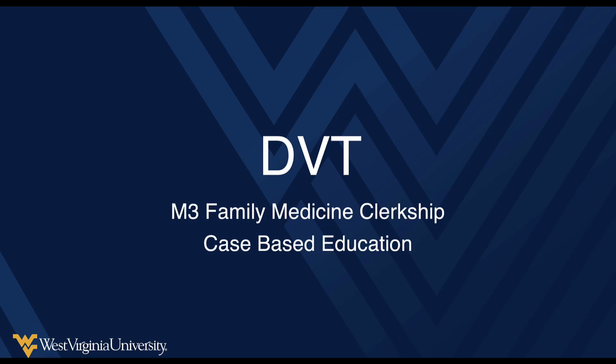Hello everyone and welcome. Thank you for joining us for this brief case-based discussion of point-of-care ultrasound for lower extremity DVT. This is primarily targeted for our third-year family medicine clerkship. However, DVTs, or suspected DVTs, are encountered across a lot of specialties, so this could really be applicable to a lot of different specialties and clerkships. So let's jump right into the content.